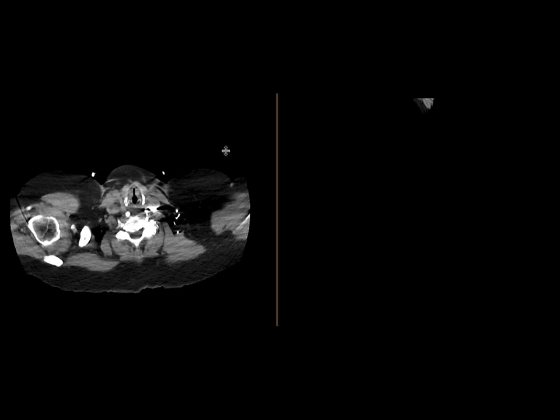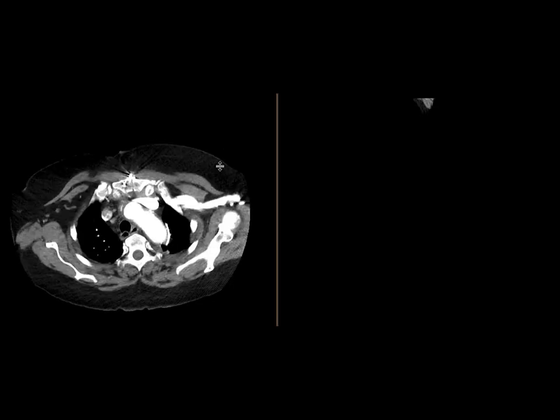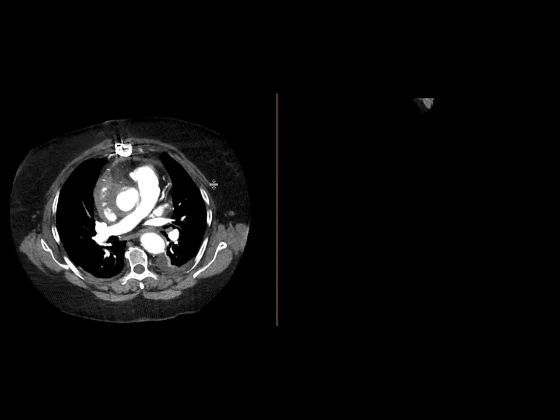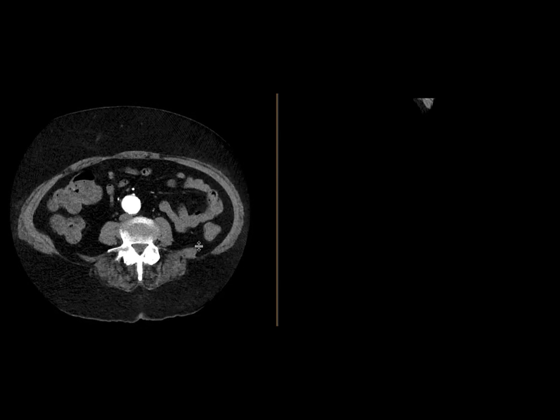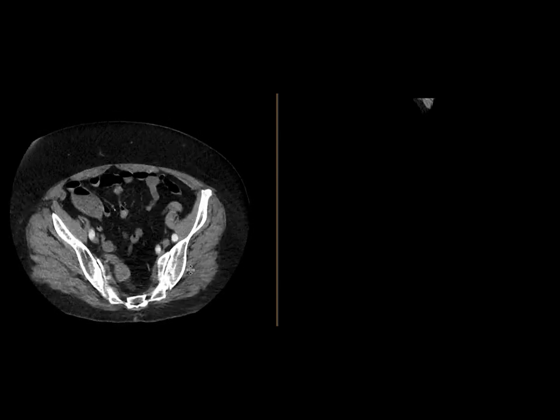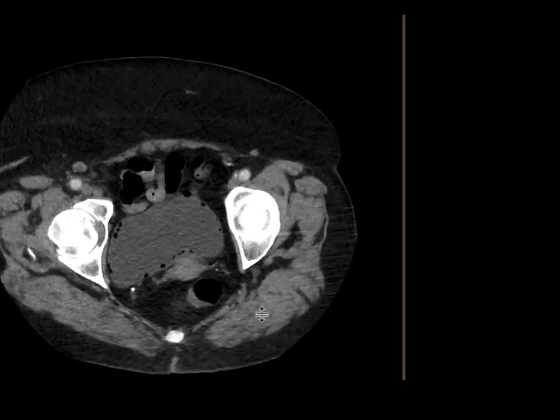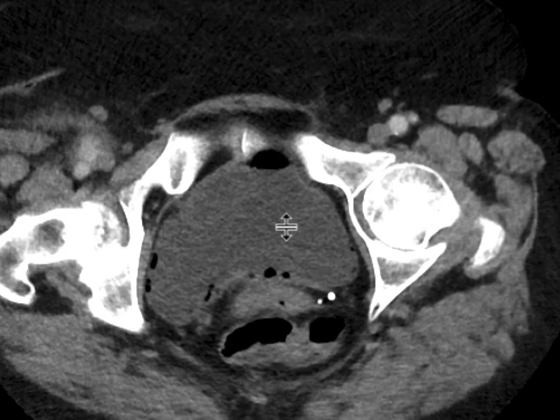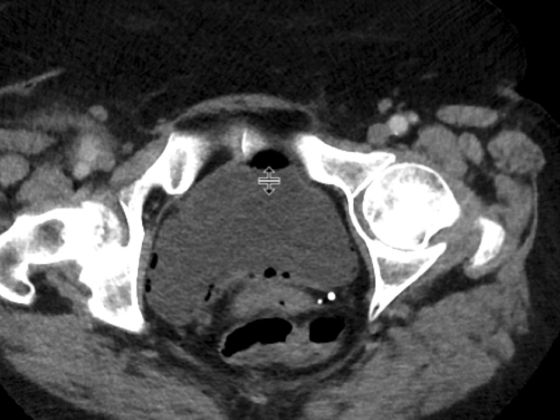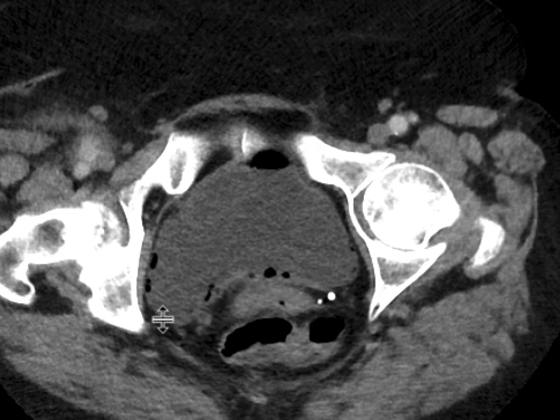This is a patient who had a prior aortic repair who got a follow-up CT scan. We'll scroll all the way down to the pelvis where we can see an abnormality involving the bladder. You do see some foci of gas within the non-dependent portion of the bladder within the lumen itself, but we're also seeing foci of gas up against and within the bladder wall itself.